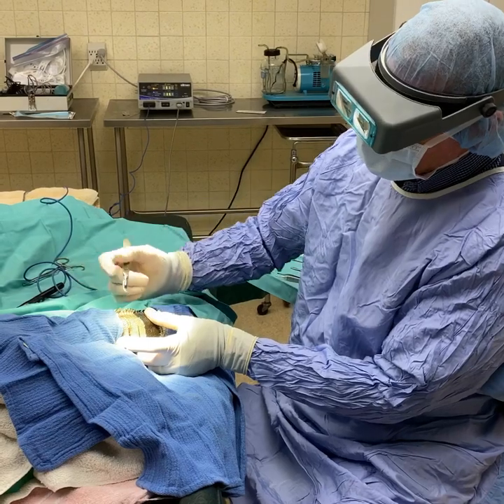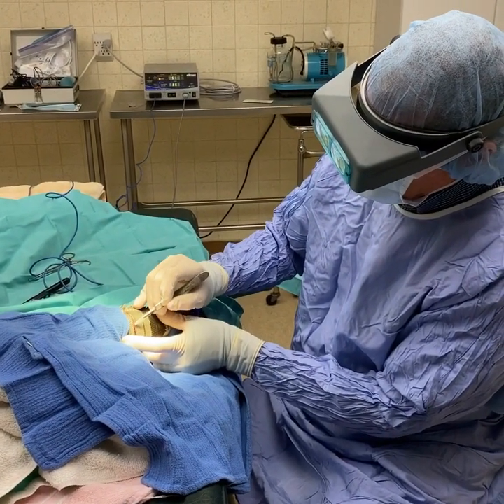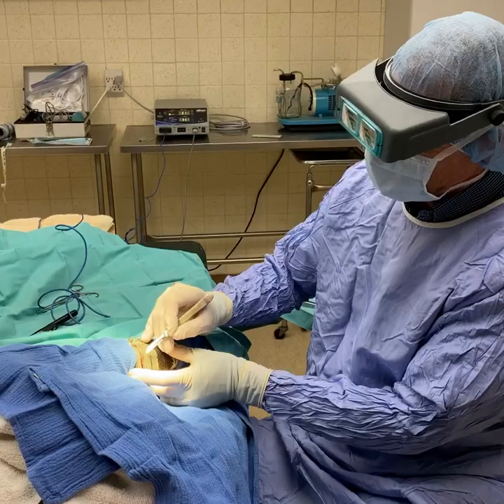We've made our initial incision and it's always best to try to make the incision between the scales as opposed to cutting through the scales themselves, as healing is much better when done this way.